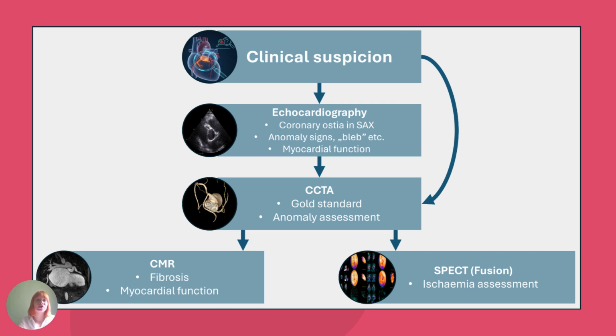It's also rather cheap without contrast, so it can be some kind of a screening tool. And if any signs in echocardiography are detected, then the patient is referred to perform gold standard CCTA.